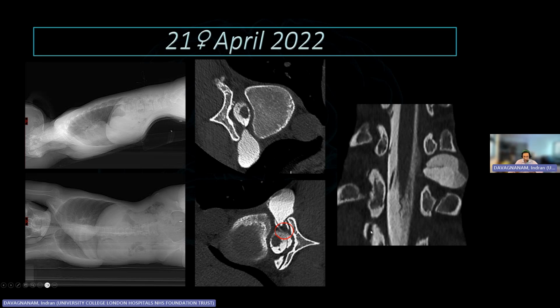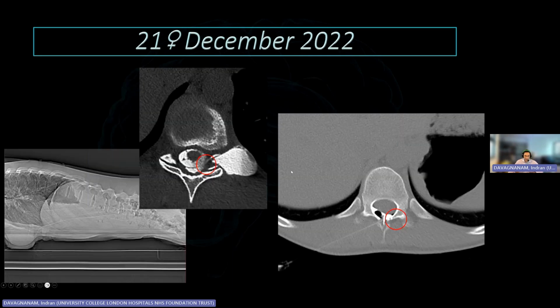so slightly complex. So I took the opportunity then to access that point where it was leaking with a needle and injected some fibrin glue, and she was cured thereafter. So one of the success stories that we had, but a very, very complex filling and drain and leak process that we were seeing.